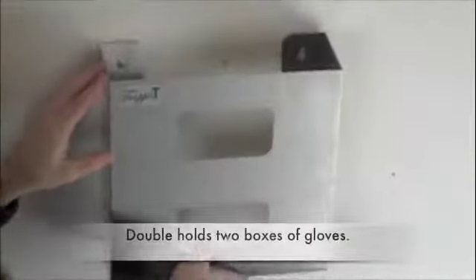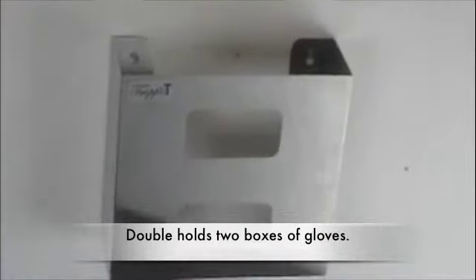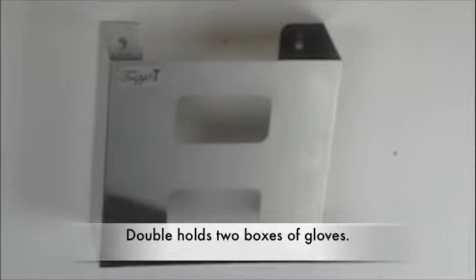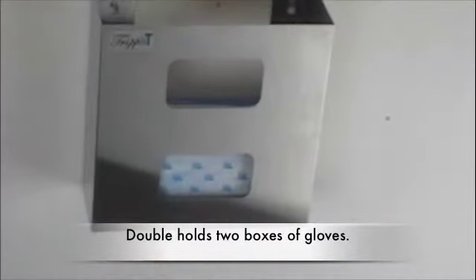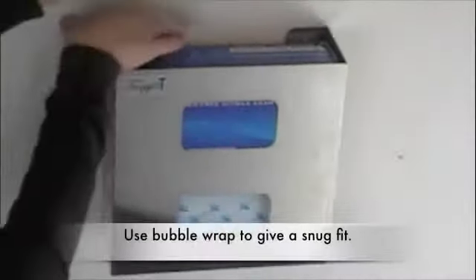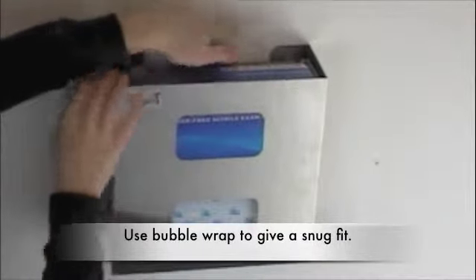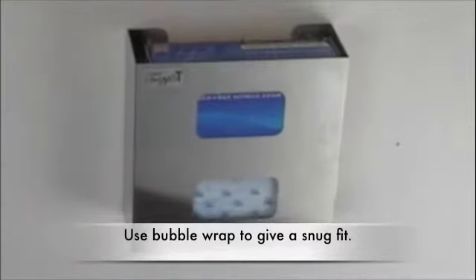This is the double glove box holder, and it has the same width between the two keyholes as the single and the triple. The glove boxes that we put in are usually smaller than the glove box holder, and then we use bubble wrap to ensure a snug fit, so that when you put your hand in to retrieve a glove, you're not pushing the glove against the wall.